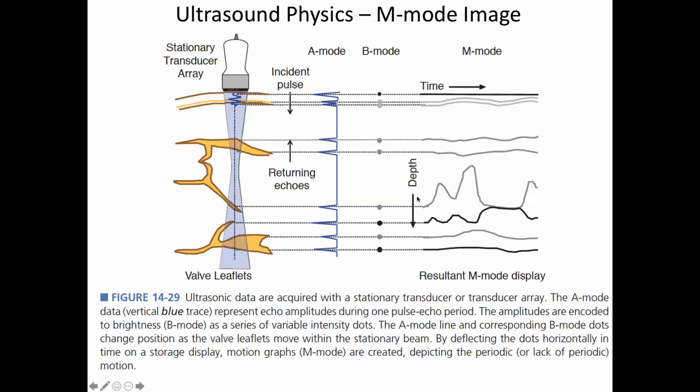And then you go over here and you look at your signal and you say, oh, I know that this is my anterior mitral leaflet, and I can actually measure the slope of that curve and tell you how fast it snaps back, right? Which is kind of cool. Like you can get these underlying physical measurements at super high frame rates, right?